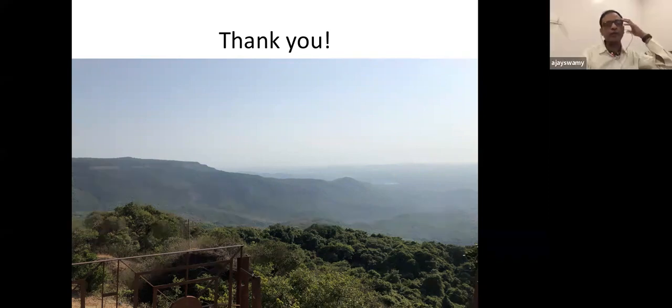Yeah, there is an important difference. If you have got a straight segment, whether you take a soft or a very hard wire, your burr has got to cross. It doesn't matter so much. The problem is only when there is an angulation. Now, in this particular patient, we had a fairly straight segment. It was angulated in the caudal view, but it wasn't so bad. It was not like a 90-degree or an 80-degree angulation. So we took a stiff wire because we wanted support for our rota wire to cross. That's why we took a more supportive wire.